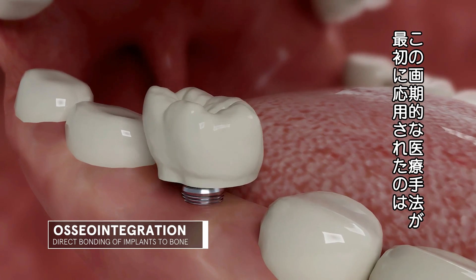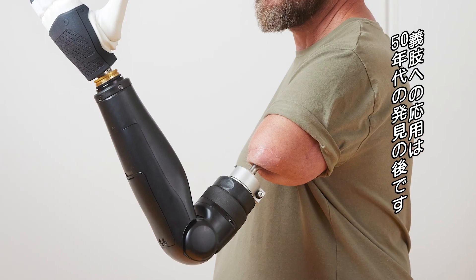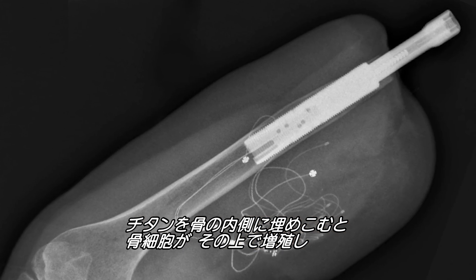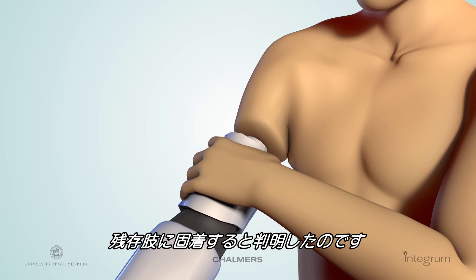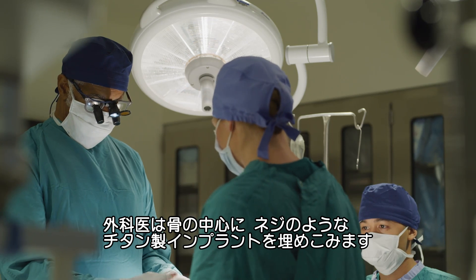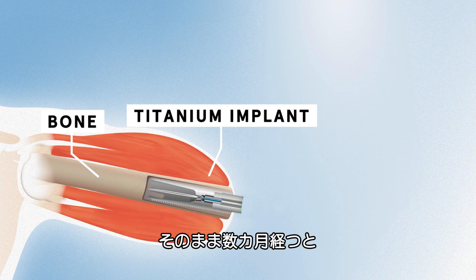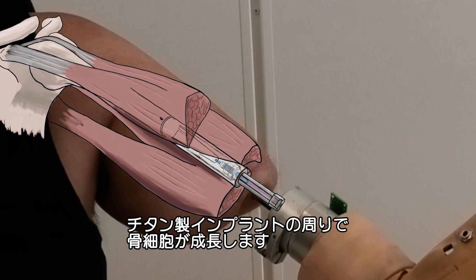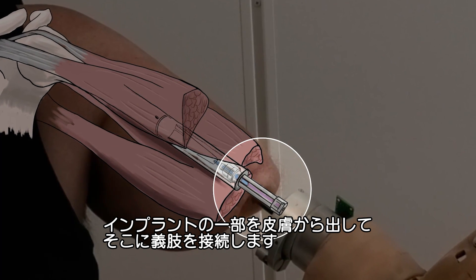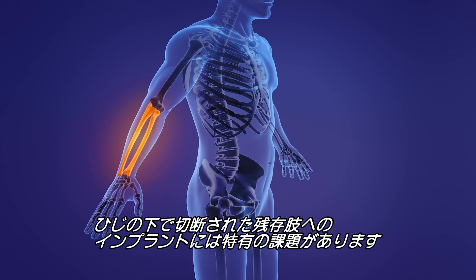Osseointegration made a big splash in the medical field — the first application was dental implants. Scientists later applied this to prosthetics, discovering in the 1950s that if you attach titanium inside bone, the bone cells can grow directly on it, making a very strong attachment to the residual limb. For a transhumeral amputation above the elbow, the surgeon places a titanium implant like a screw inside the center of the bone and leaves it for a few months. The bone cells grow around it, then a portion of the implant is brought out through the skin, where the prosthesis will connect.